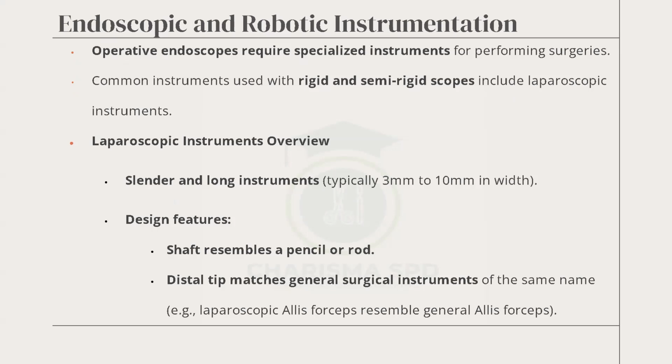Operative endoscopes require specialized instruments. Operative endoscopes require specialized instruments for performing surgeries. Common instruments used with rigid and semi-rigid scopes include laparoscopic instruments.